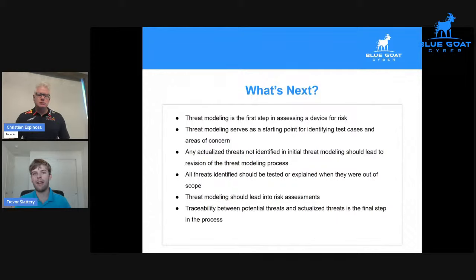This is security by design, which is always going to be better than security bolted on after the fact. The FDA explicitly calls out the total product lifecycle, development environment, and security considerations early on as some of the most important steps to take when designing a device. So making sure that threat modeling is done early and often is very important.